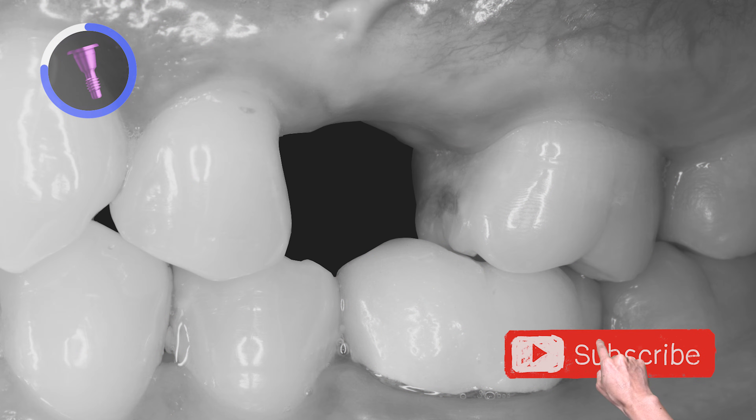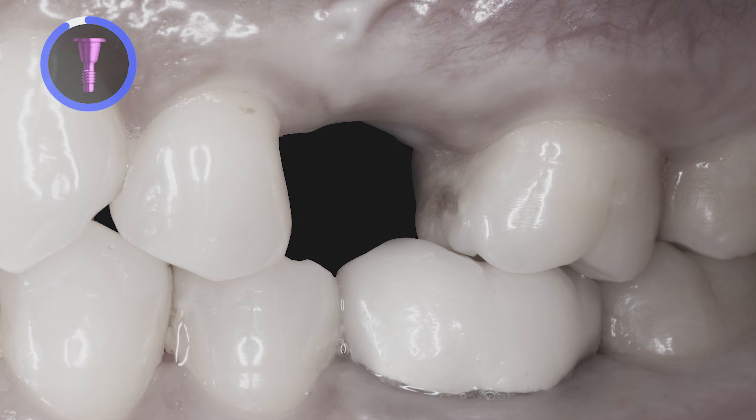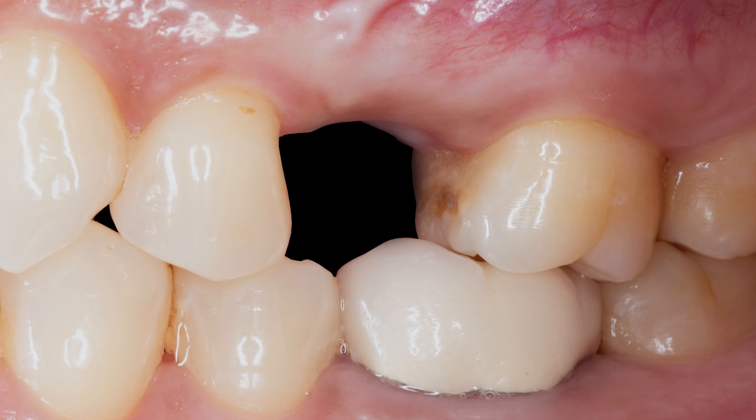To save time, I typically scan the opposing and full arch working scan at the beginning of the appointment while the local anesthetic is kicking in.